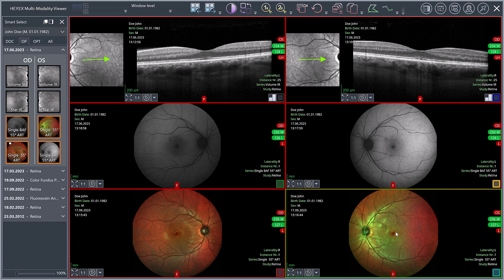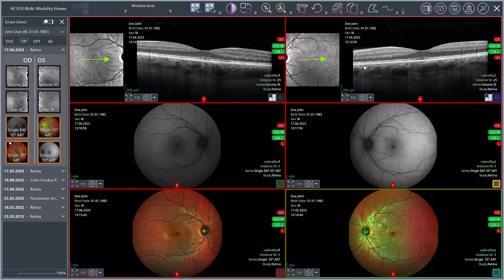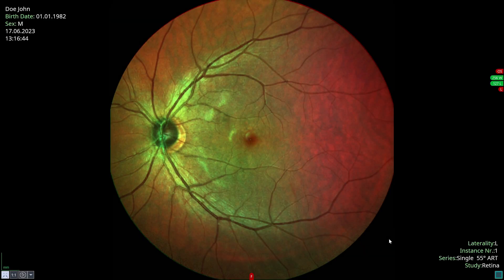If you want to rearrange the images, click the box in the bottom right corner of the viewport and drag and drop the image to the desired position while holding the left mouse button. To enlarge an image, double click the image. Double click again to return to the previous view.